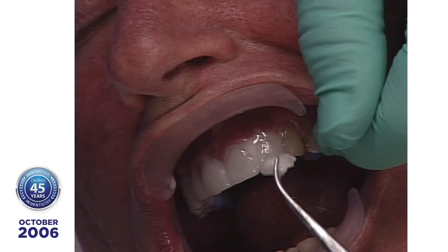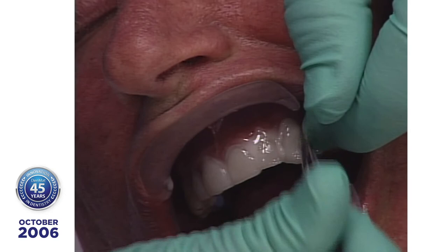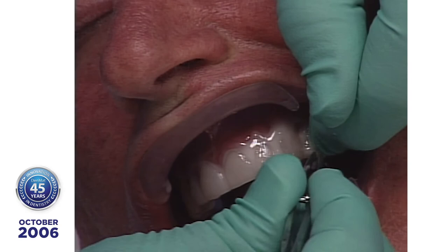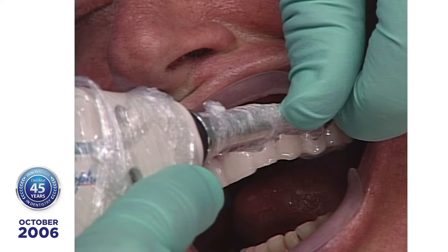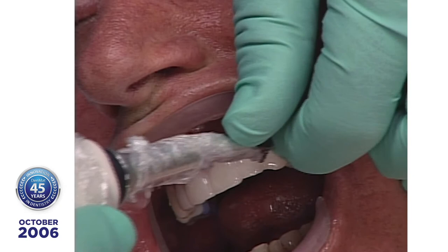Lisa always calls out and tells me the name of the tooth. That was the left first bicuspid, right? And I always stay one tooth distal from the last tooth before I put on the 1 second. Close your eyes. Close your eyes. And close your eyes.